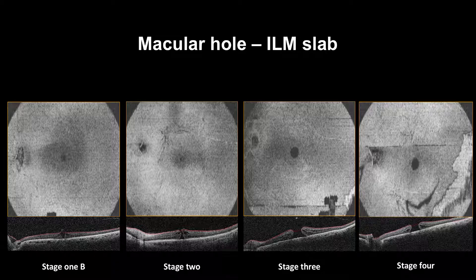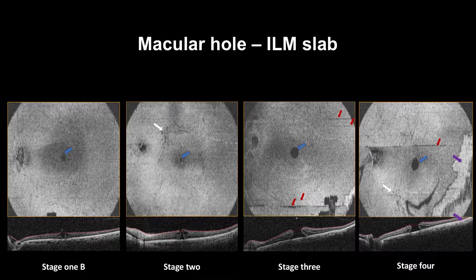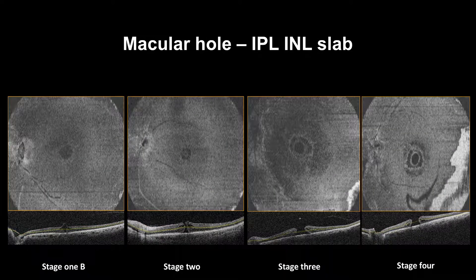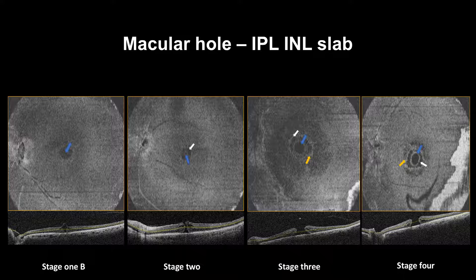In cases of full thickness macular hole, the ILM slab will show a hyporeflective circle that can appear in different sizes according to the hole size, resembling the hole, and can show the epiretinal membrane location or vitreous traction. Please note the blink and segmentation artifacts. The IPL-ILM slab may show a hyporeflective circle surrounded by a hyperreflective border and then surrounded by cystic changes, resembling the central full thickness macular hole and intraretinal cystic changes. The slab will show prominent irregular hyperreflective borders in stage 3 and 4.